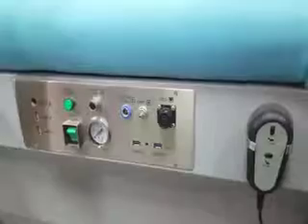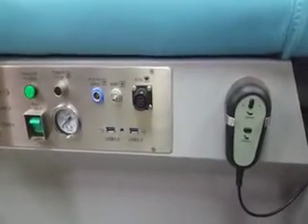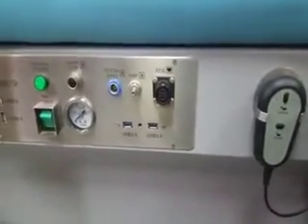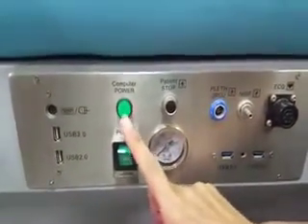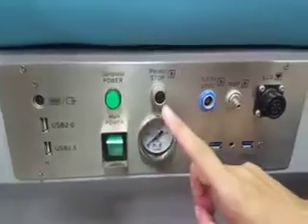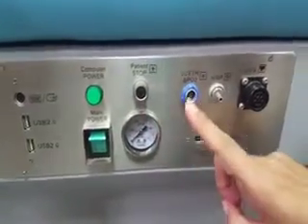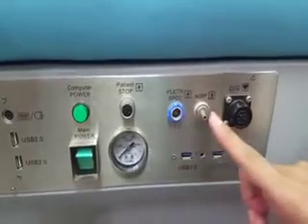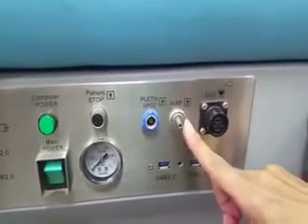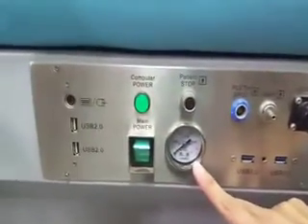Let's introduce the front panel of the ECP machine. On this panel, you will find the main power switch, computer power switch, patient emergency stop button, oxygen saturation button, NIBP button, ECG cable, and air pressure gauge.